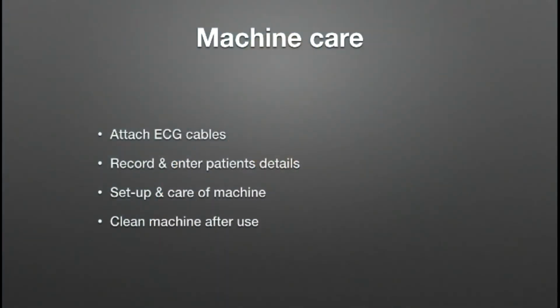As I mentioned, these machines are expensive and they've got to be looked after appropriately. Some machines are more robust than others, and some of the transducers are more robust than others. But there are delicate components to this that need to be looked after appropriately. In particular, the transducers themselves with the piezoelectric crystals that are an integral part of the machine, as well as the cables. And it's important that you pick up the cables after you've been using it or when you're about to use it, and you don't run over the cables with the wheels of the machine, because that will break them and then you're not going to be able to do your study.